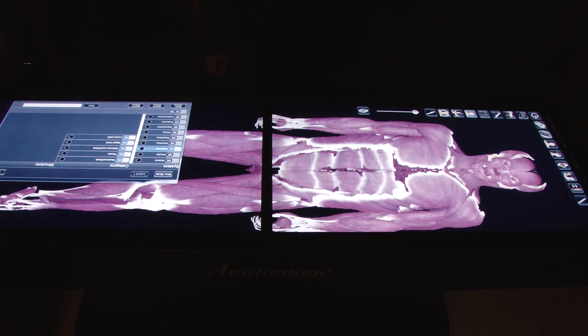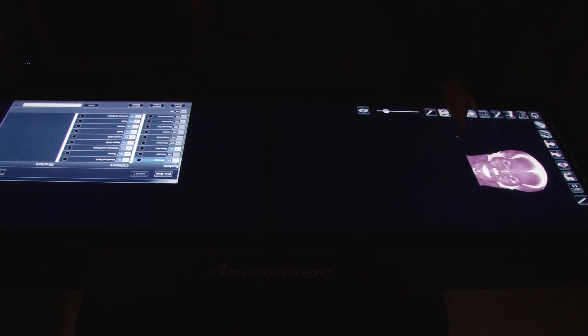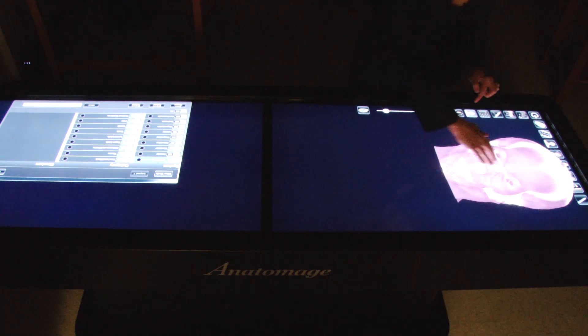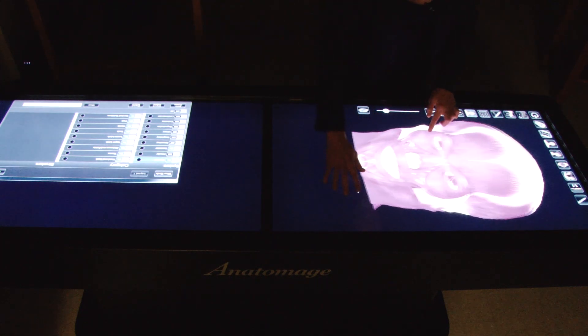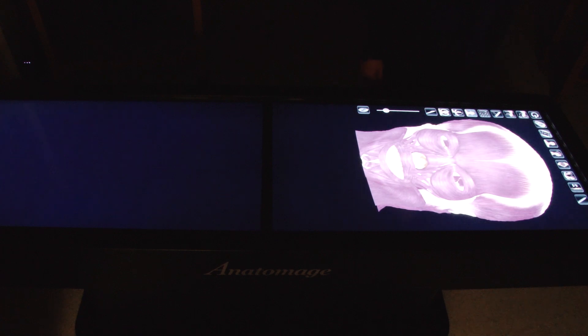Even a human cadaver does not allow students to do this type of study. In the Anatomage Table, students can isolate individual muscles or bones or structures. They can enlarge areas of the body in the high-res scans and see them very closely.